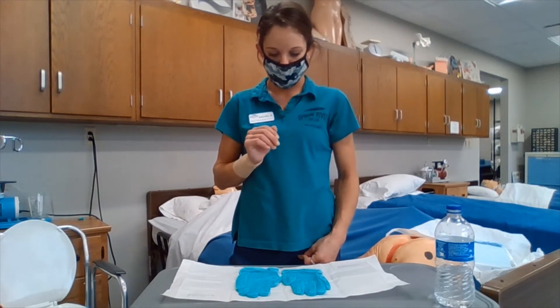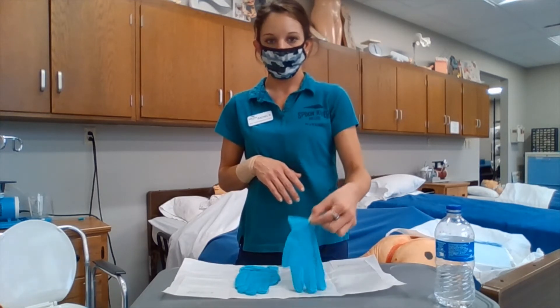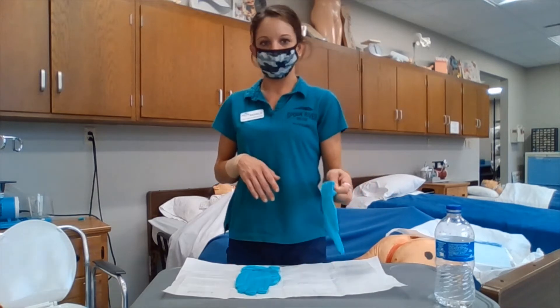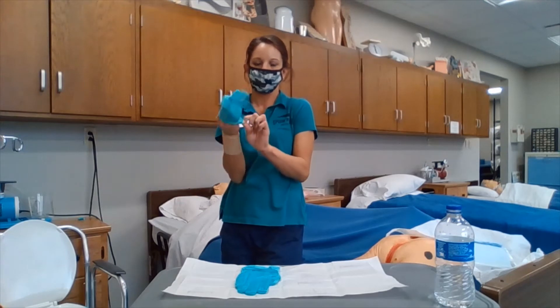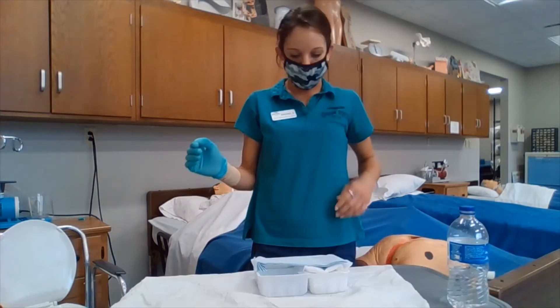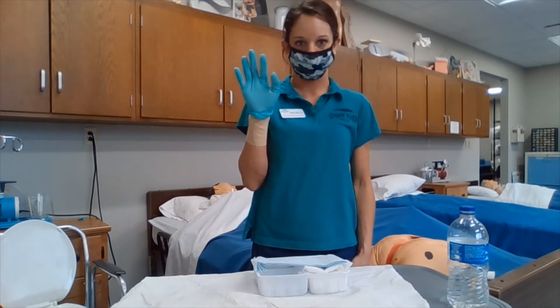Right now we are just going to be applying our dominant hand glove. In doing so, we are going to go ahead and pinch the inside of the cuff, which that part is not sterile. We are going to make sure that we are stepping away from our sterile field and putting our glove on, making sure that we are not touching the outside of the glove and we are keeping our hands above our waist and in front of us. We will be using our sterile dominant hand that is gloved to empty out our supplies from our sterile field.